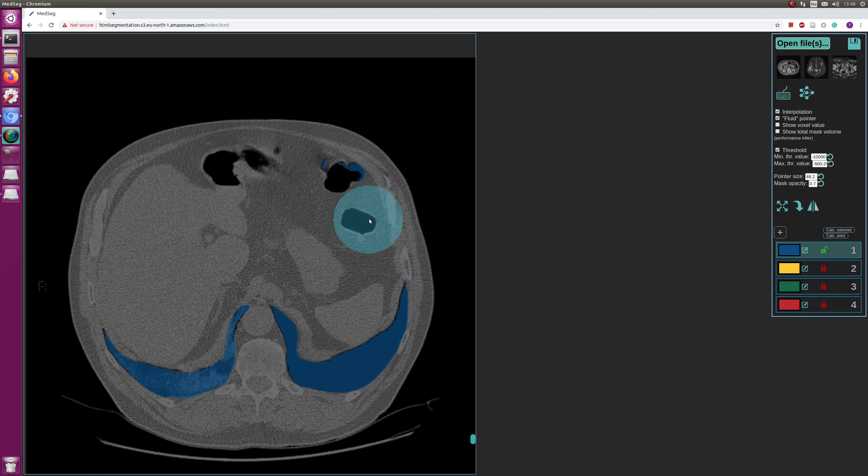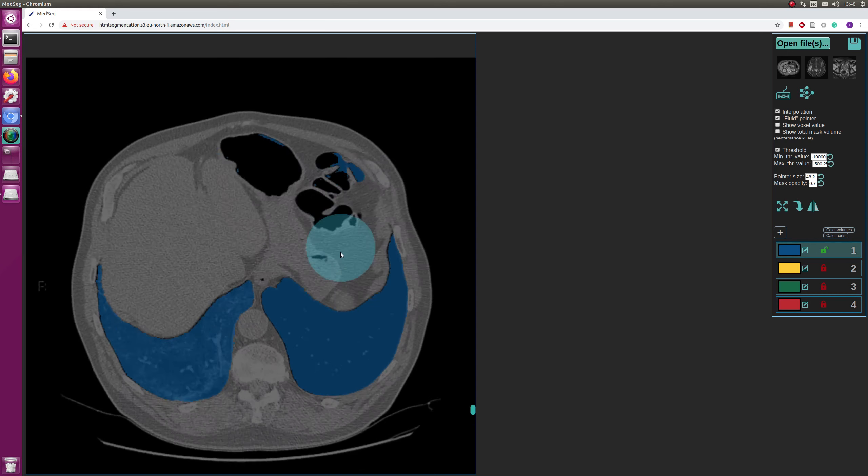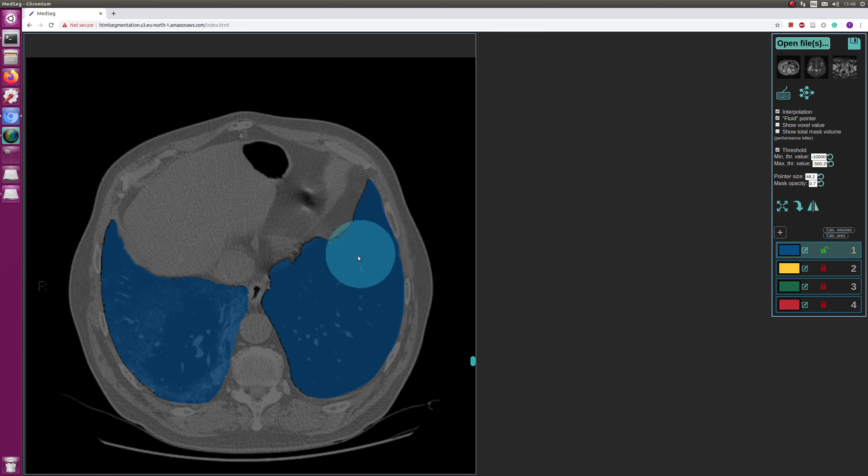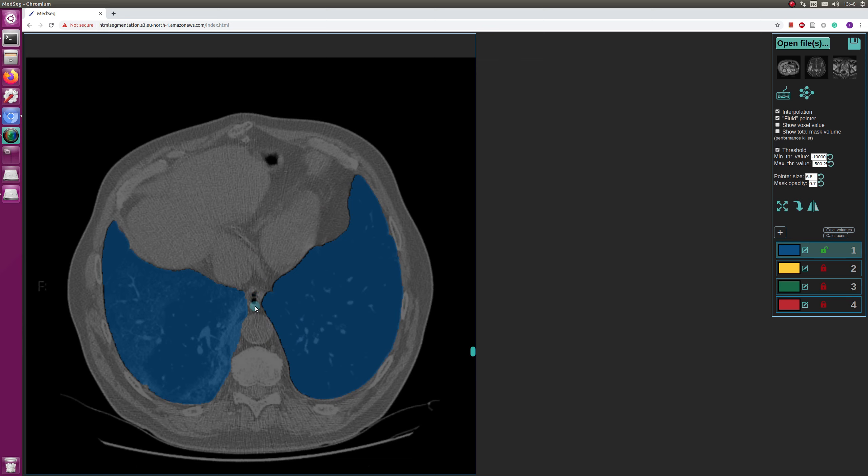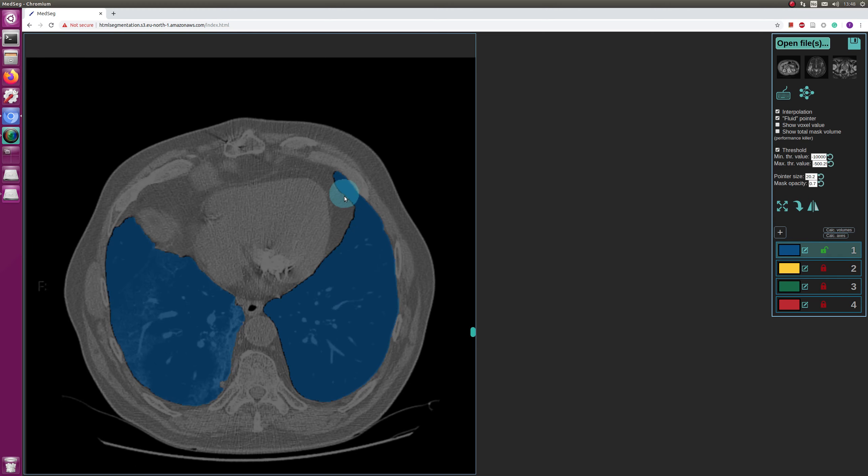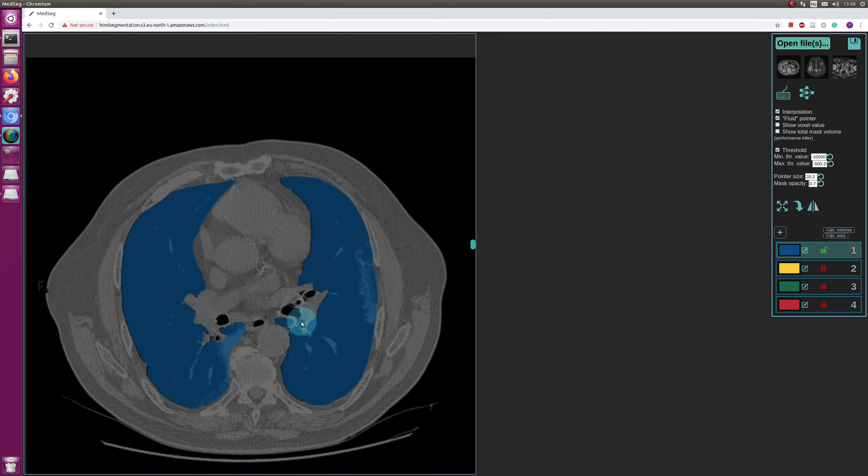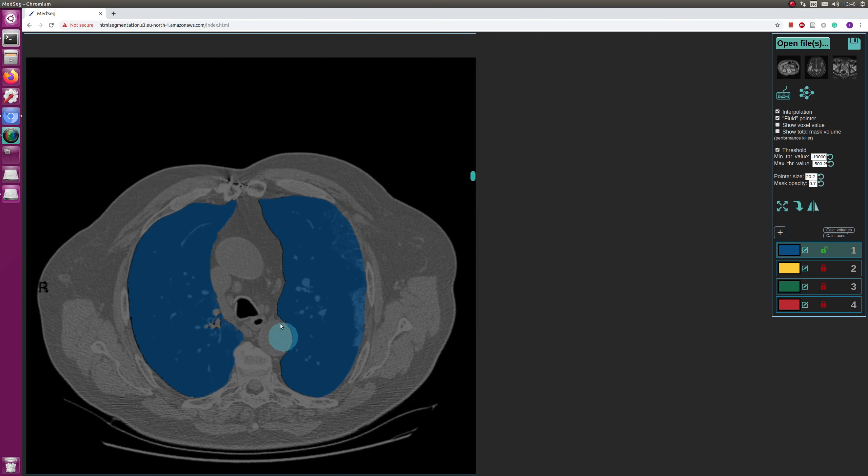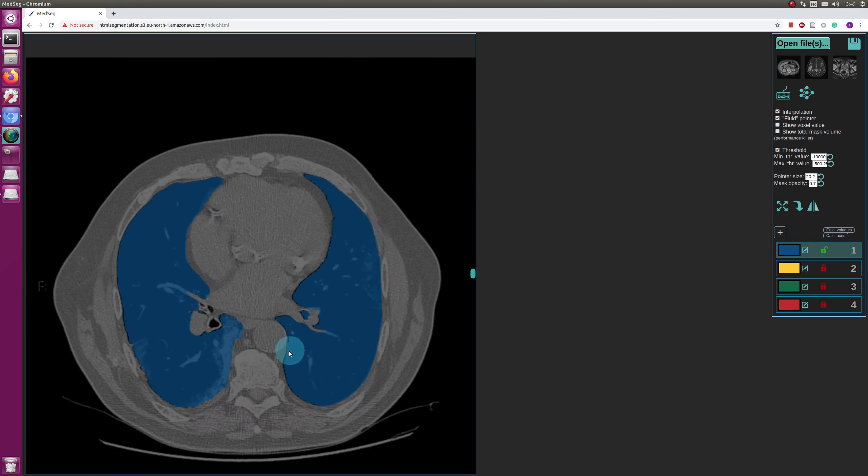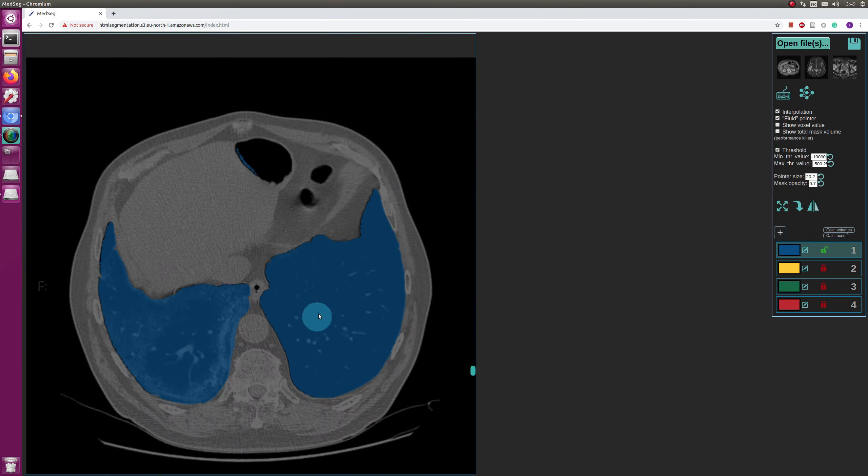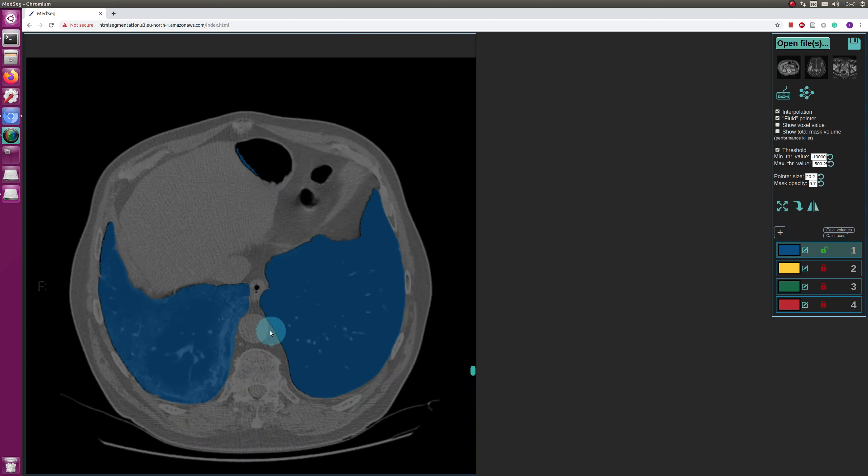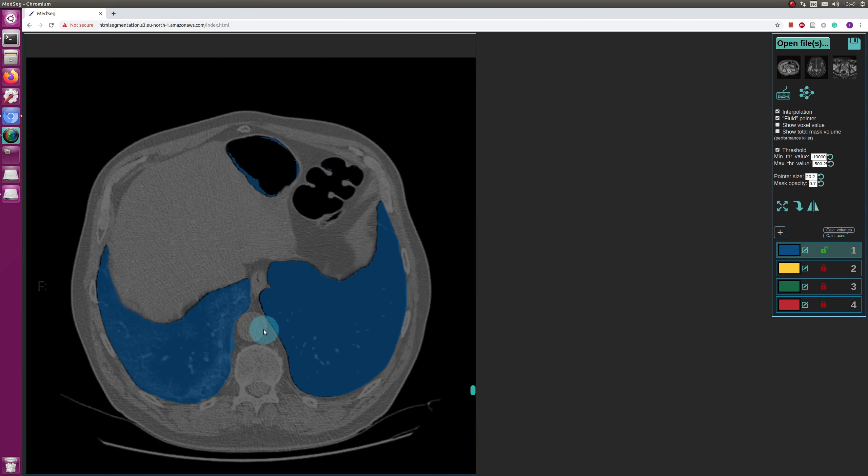Okay, now to remove all of that, what I can do is I can use a function which basically removes everything that's not connected to the point that you're holding the mouse over when you activate the function. I hope that will be clear what happens. So first I have to make sure that both lungs are connected, because otherwise it will remove one lung. So I think they're not connected, so I'll just make a connection like that. So now they're connected, and now I activate the function.